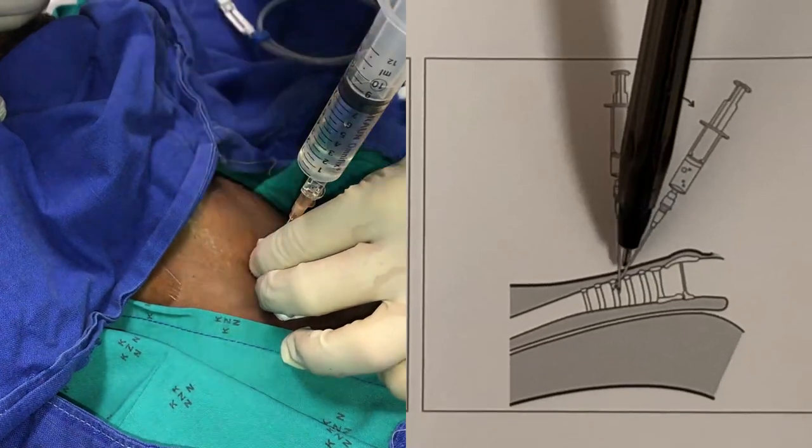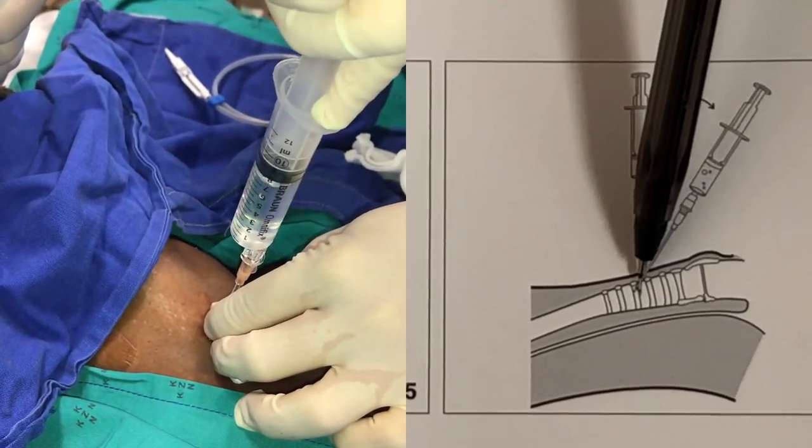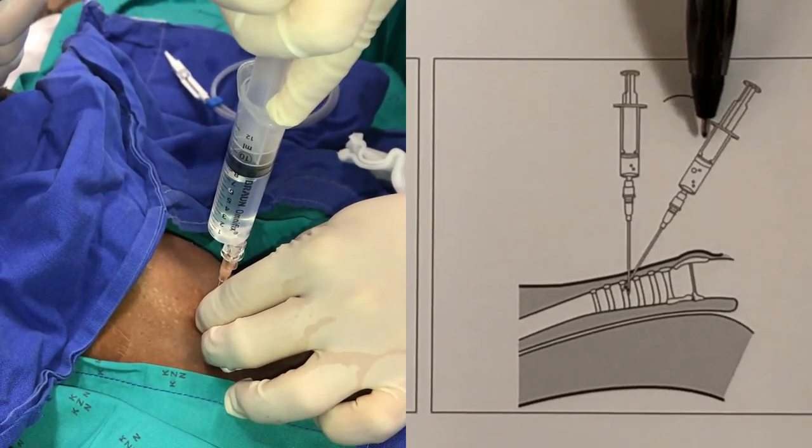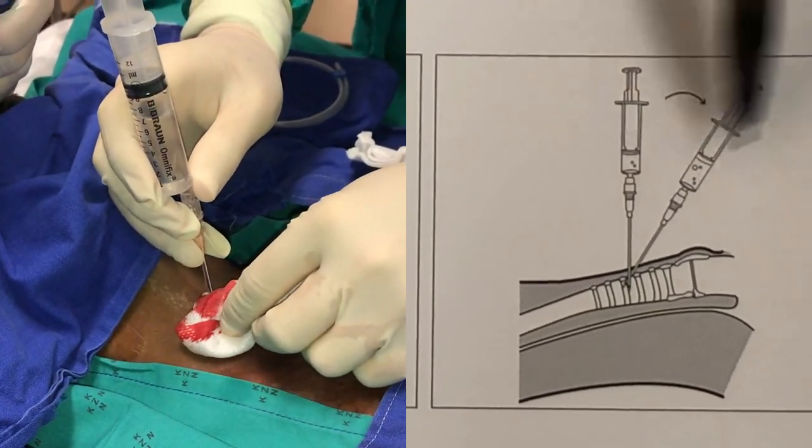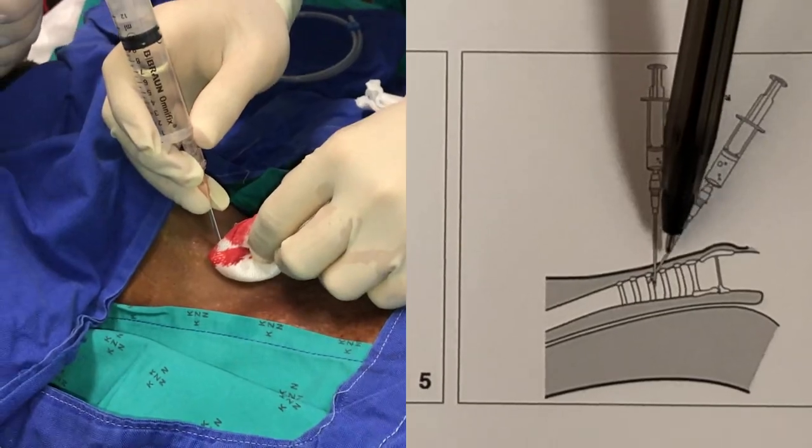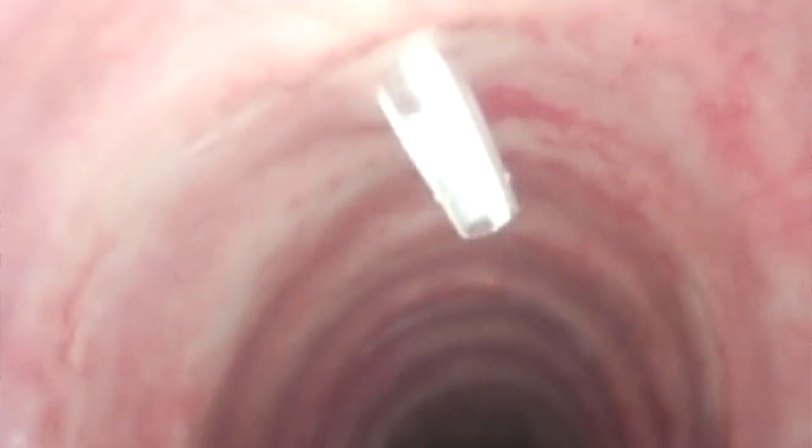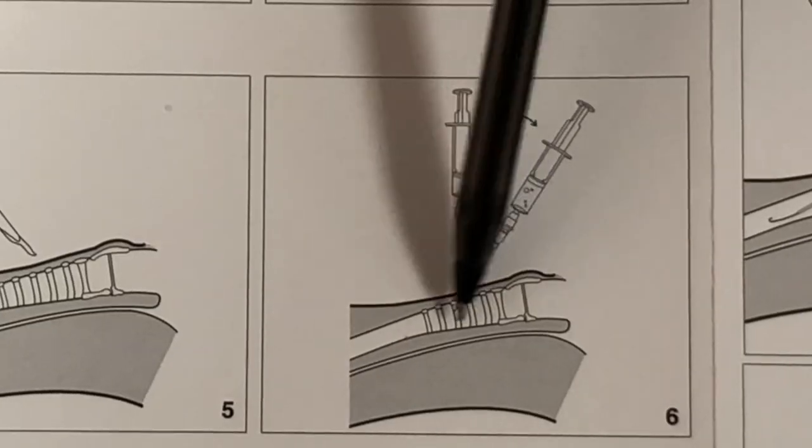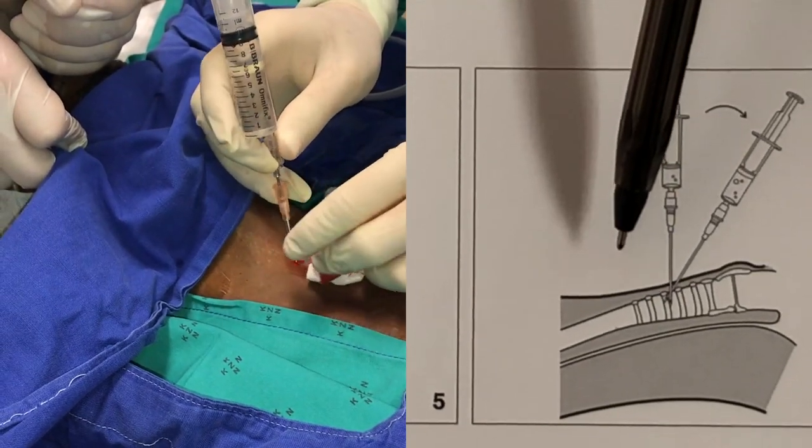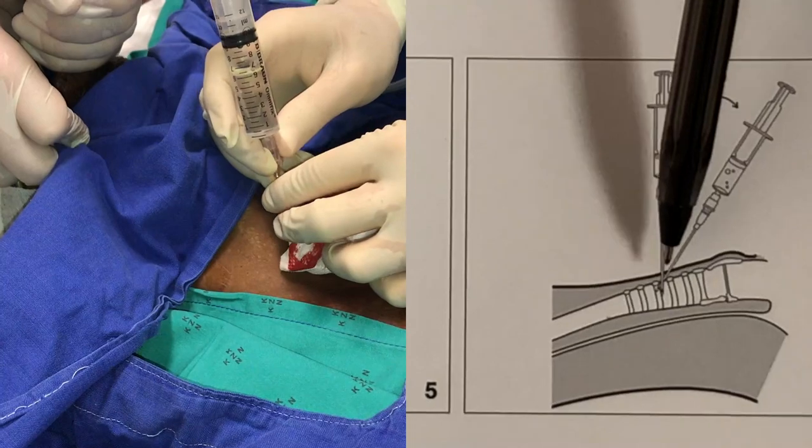Once you're sure that the IV cannula is itself in the trachea, let the tail of the syringe needle complex go towards the patient's head to about a 30 to 45 degree angle, and then slide the IV cannula off the metal needle that you hold constant. At this stage it is vital to ensure that the cannula slides in with no resistance; it should almost fall in. If that doesn't happen, you're in the wrong place or you're too deep. Stop and restart with a new IV cannula.